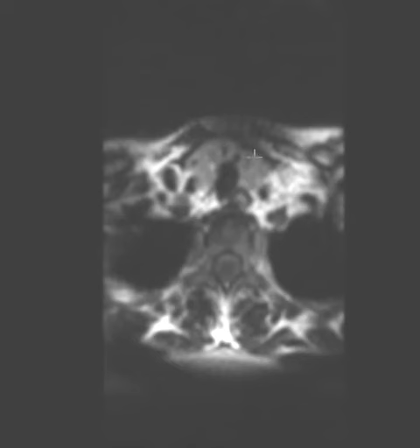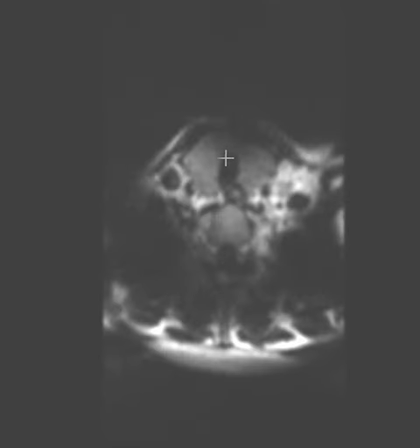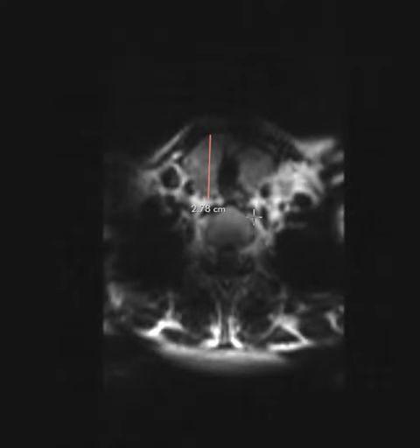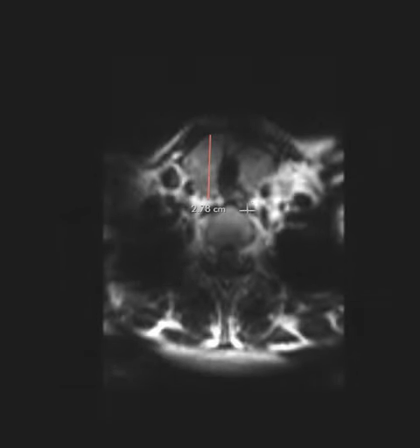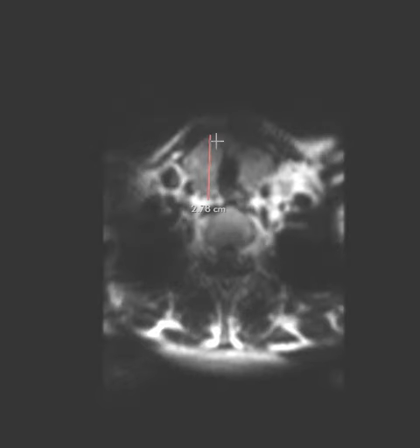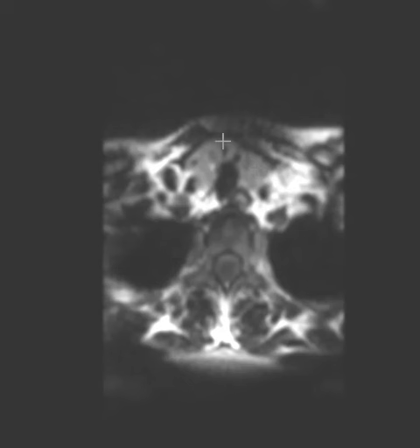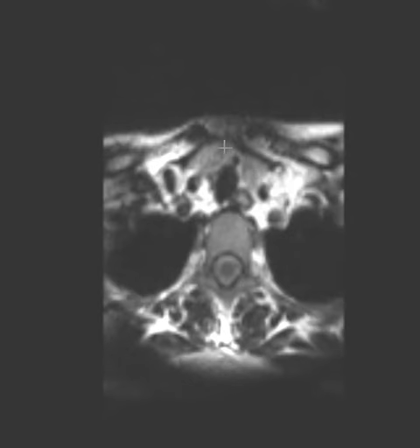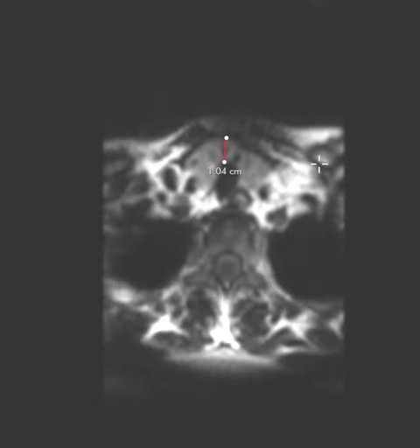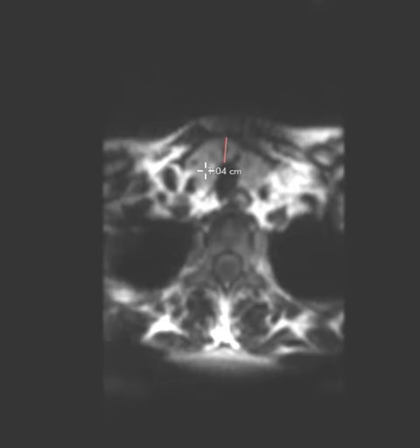The thyroid tissue is this in the middle and over here. Now on the right side I have a measurement of 2.8 centimeters from front to back. Normally the thyroid gland will be less than two centimeters, so this is much too large. The thyroid isthmus, which is right in between the left and right lobes, should be less than three millimeters. We can see this is much too large, this is one centimeter, it's more than three times too big. There's some little areas of darkness and little areas of subtle increased signal, these are little thyroid nodules.